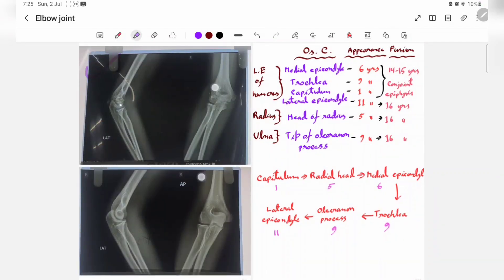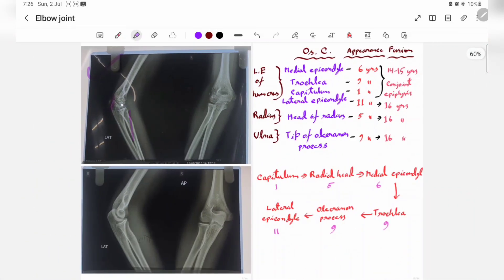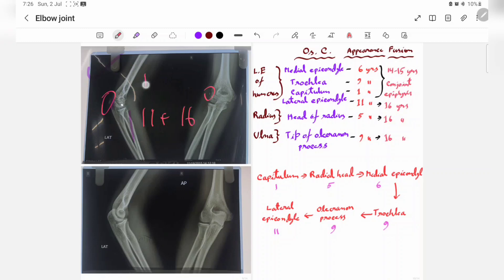In this fourth X-ray, the head of the radius has already formed and the olecranon process has formed but not fused. The lateral epicondyle is visible as a small white structure, so the person is 11 years or older. The medial epicondyle and lateral epicondyle have formed but not fused, and the person is below 16. Therefore, the age is 11 to 16 years.